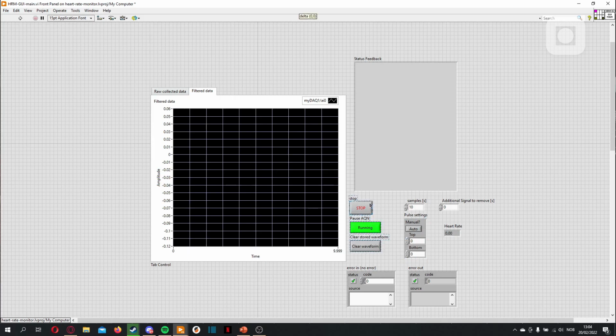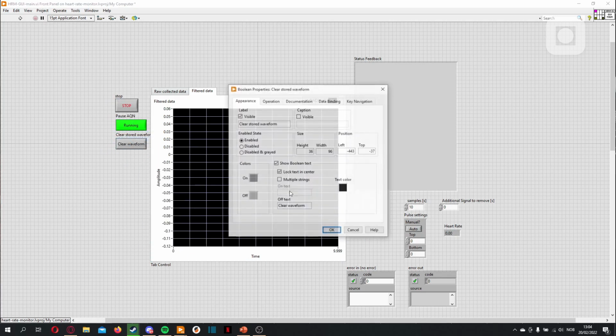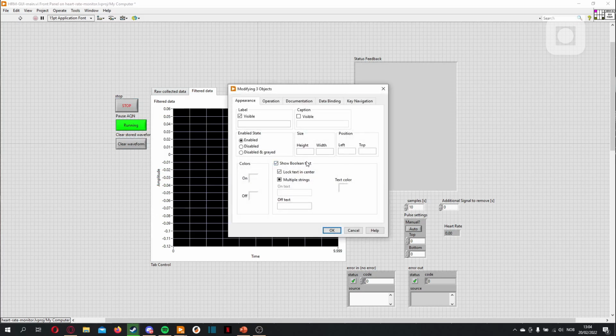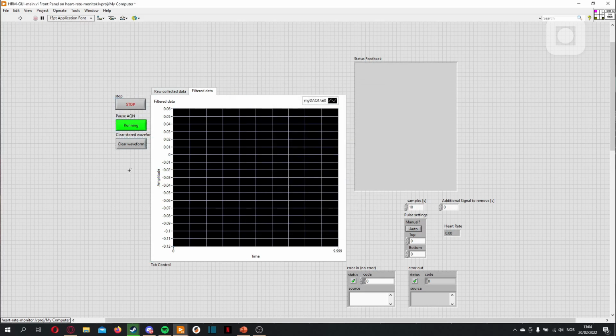Now we can move the buttons. We can make all of them the same size. I think this size is nice. So we'll just do 36 by 96. We'll mark all of the buttons, open properties, and write 36 by 96. That's how you make a lot of buttons the same size.